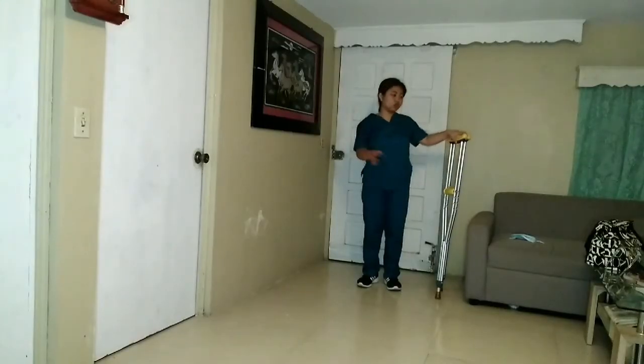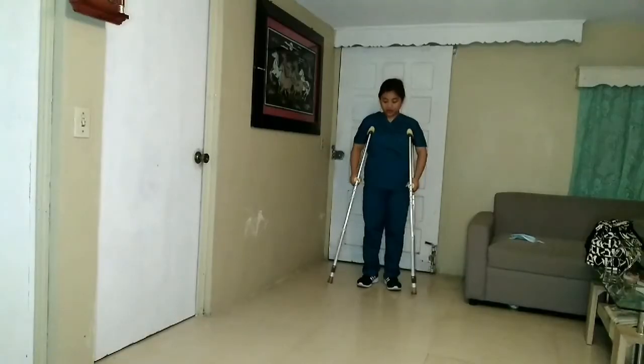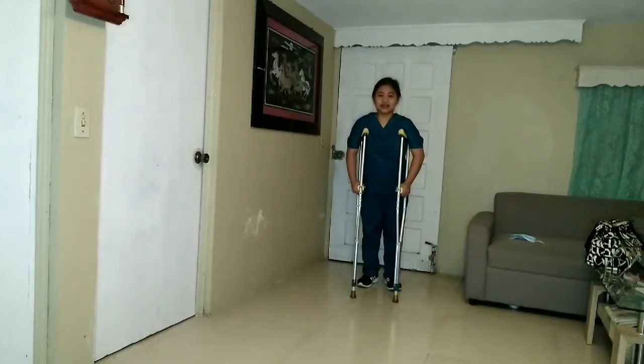Instruct your patient to use the swing 2 gait. Begin with tripod position. Move crutches forward. Lift and swing the leg to the crutch and let the crutch support your body weight.